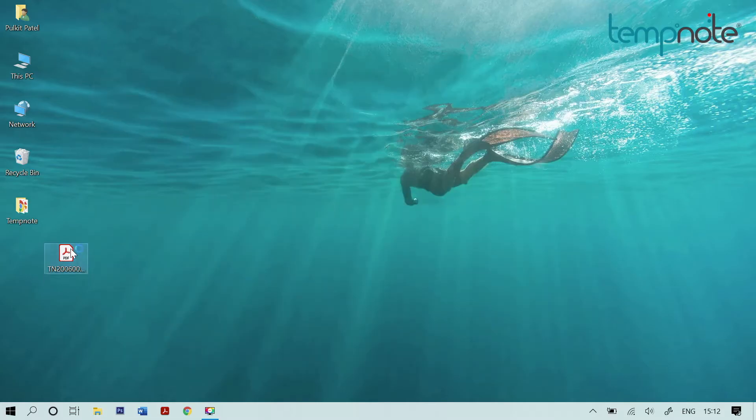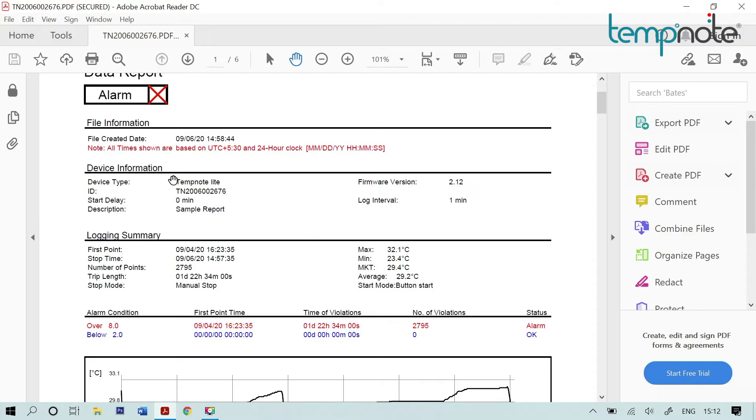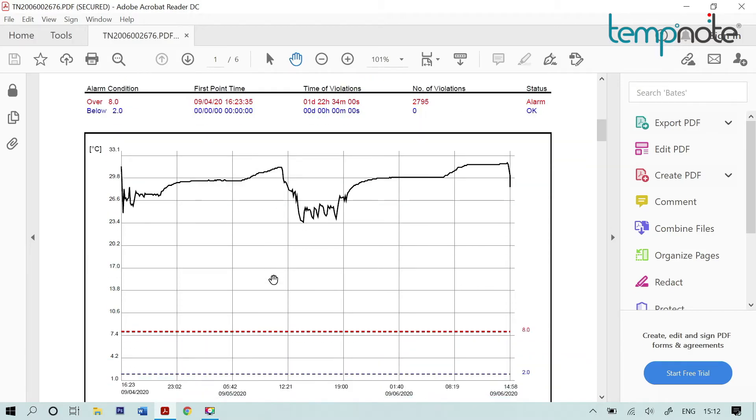Double click on the PDF file to view the data report. The first page of the report shows a summary that includes maximum and minimum temperature, and mean kinetic temperature, also referred to as MKT. The first page also shows data in graphical manner for easy understanding of temperature fluctuations during transit, from pickup till delivery.